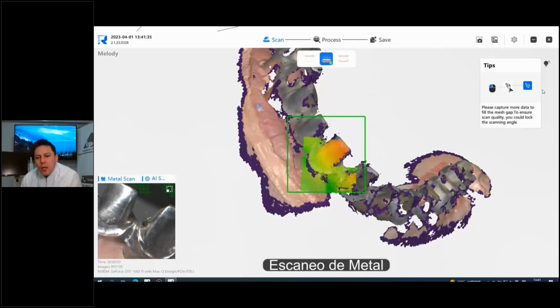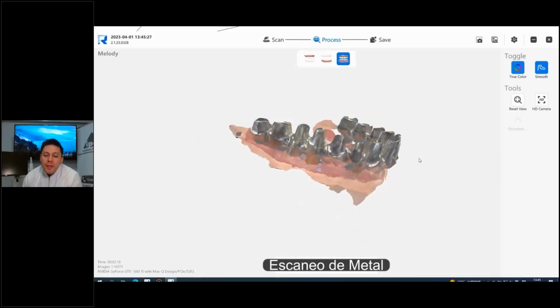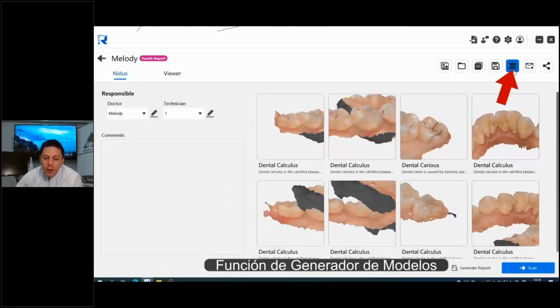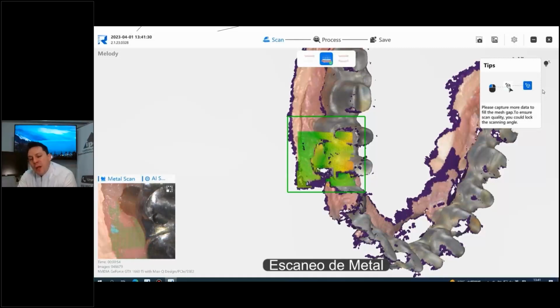It is a very, very good option, because there are so many times in our clinical life that an implant comes to our office that is not very well positioned, and the direction of the implant is not the one that we want. There is not a way to solve it if we don't do a substructure, a metal substructure or an angulated pin.